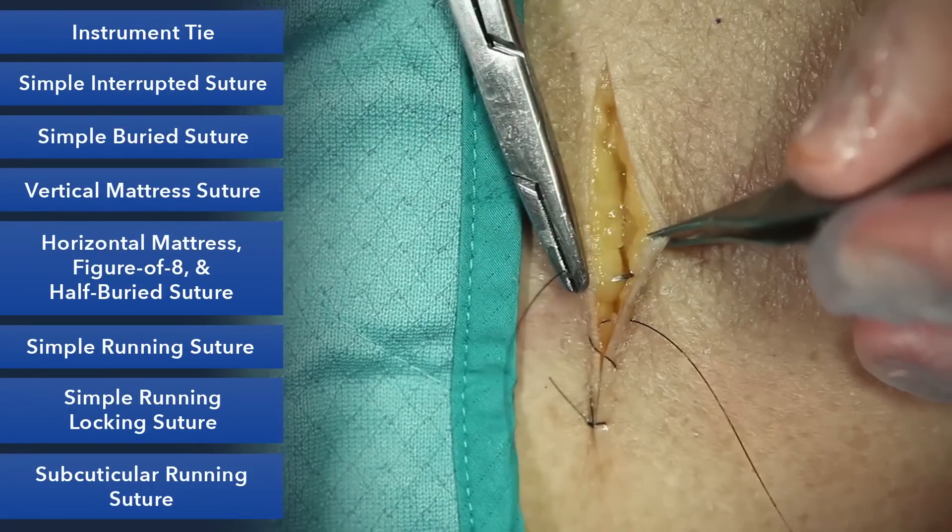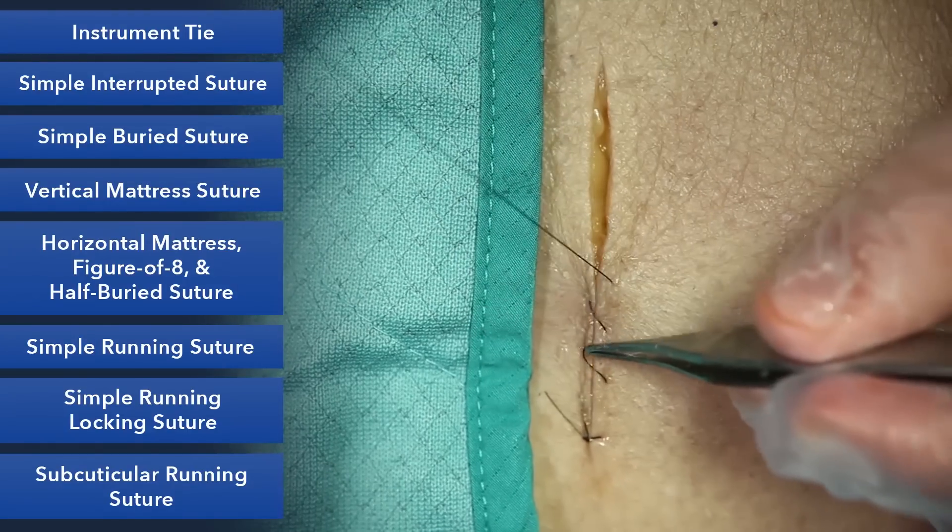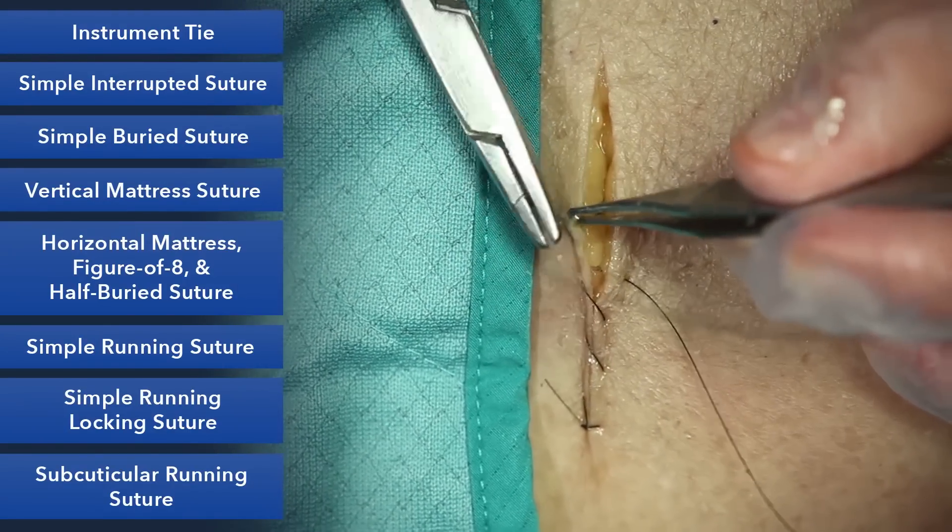If you move along the same distance each time and take the same bites on each side, you'll have a beautiful cosmetic closure.